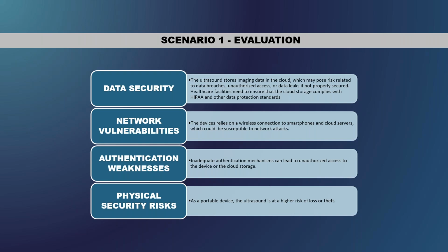So like I said, we did deny this piece of equipment, but it's just because we needed more information. We needed a better solution that we could control. Like for the phones, it'd be nice to have a personal phone. Let's recommend having a hospital phone that we could procure and control the IP base of the system. Make sure that it's identified in the access control list of the system itself in the ultrasound. So yeah, that's scenario 1.